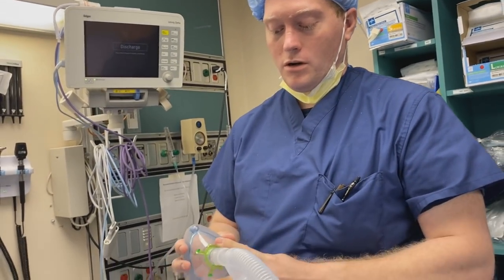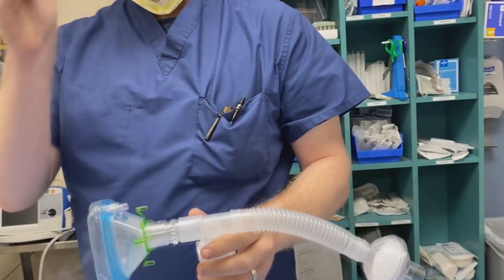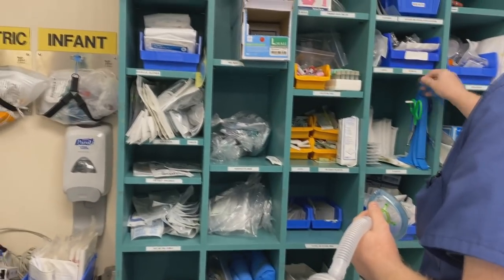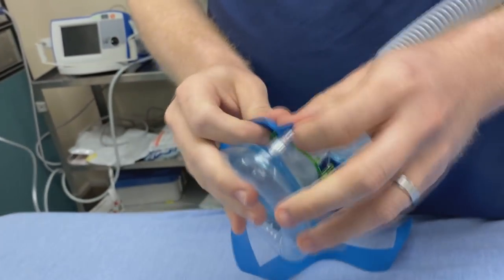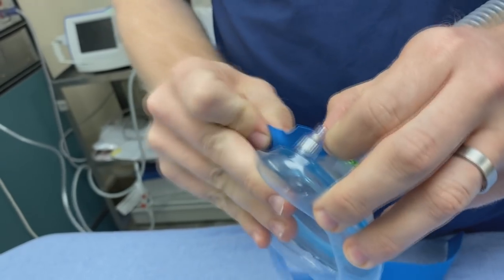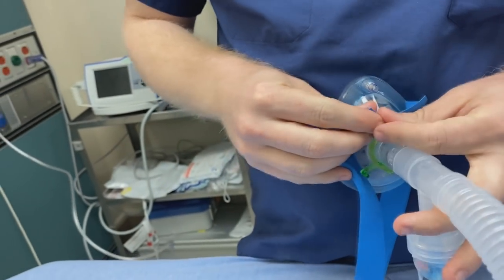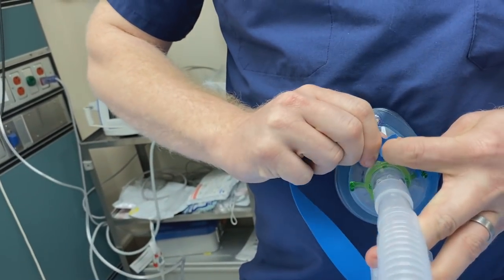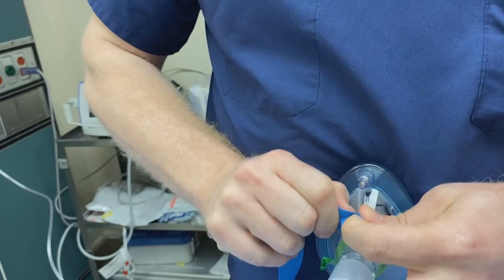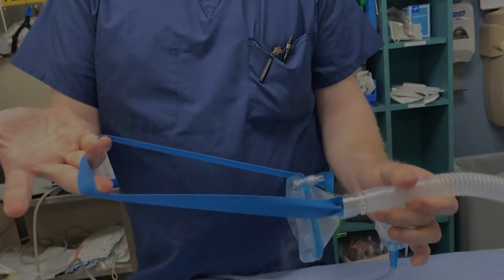As we discussed, on these larger masks you can improvise straps. Let's grab a couple just to show — you pop them onto the spider pieces, one above and one below, wrap it around the patient's head at the desired tension and just pop it in. You need one above and one at the nape of the neck, and under tension they hold.